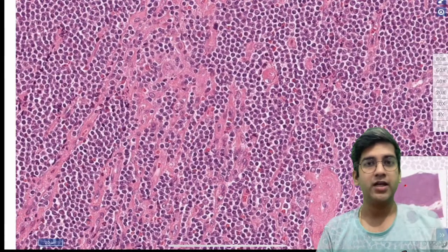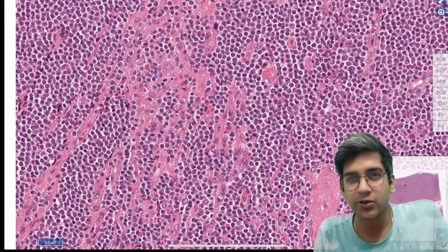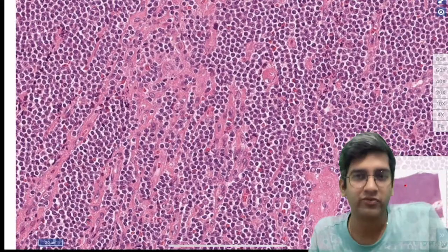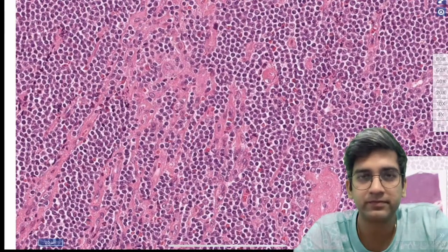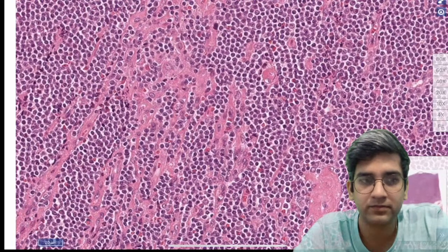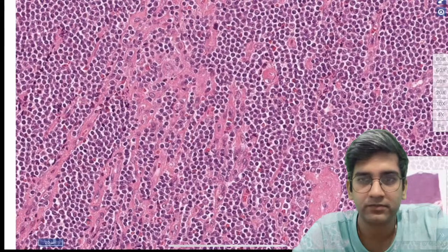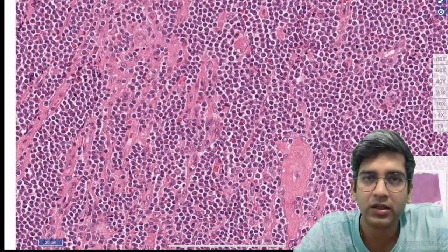Yes. Okay. So now we have studied a little bit of theory about 4 different small cell lymphomas, diagnostic pointers. Where do you think it fits in most often? What could be your most probable diagnosis here? Will you fit it into mantle? Maybe, maybe not. Yes, it looks like a mantle.